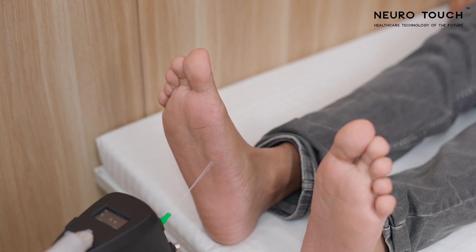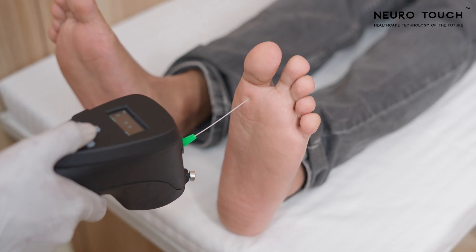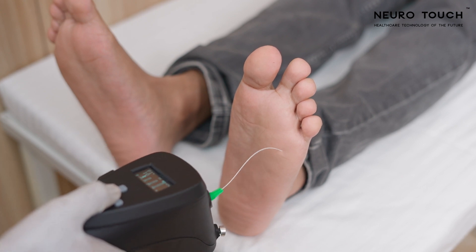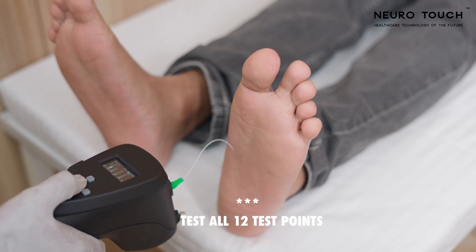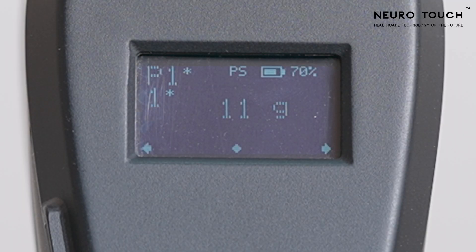The test proceeds to the next test point. After screening all 12 test points, come back to the home screen by long pressing the left key.